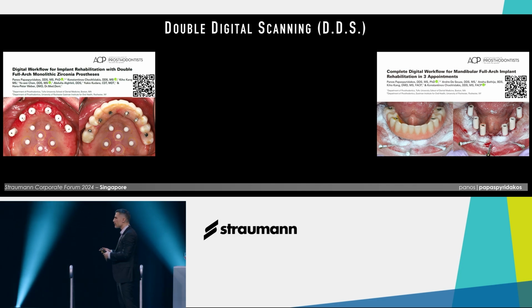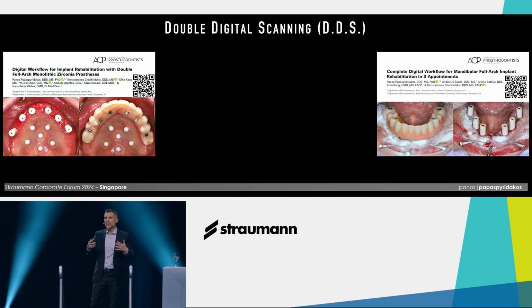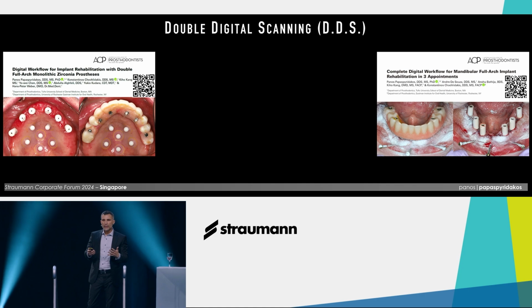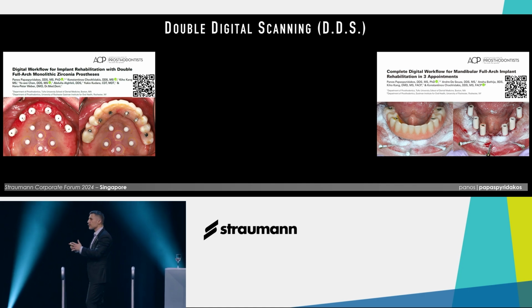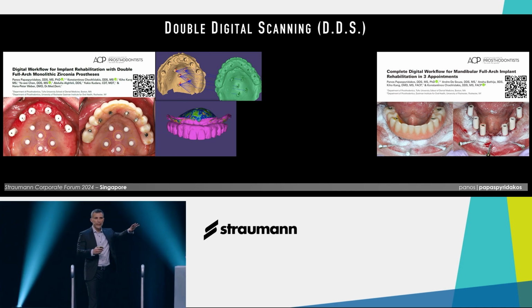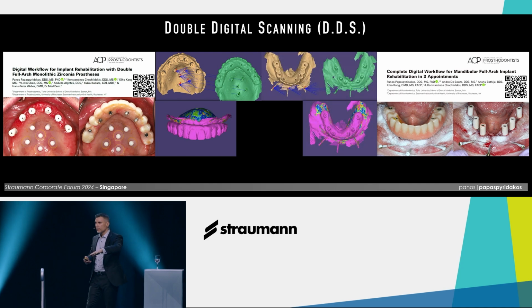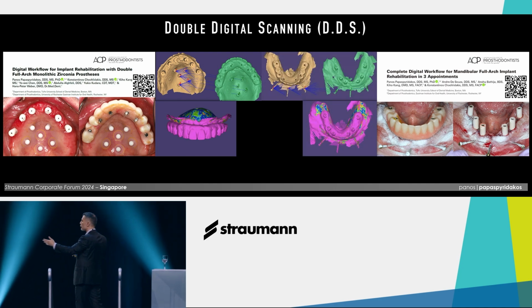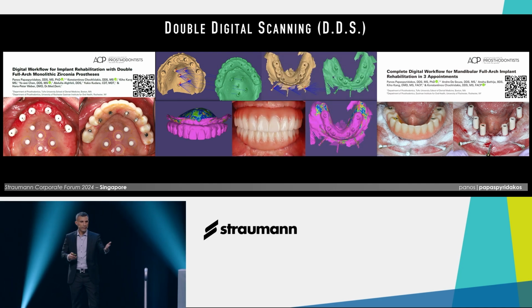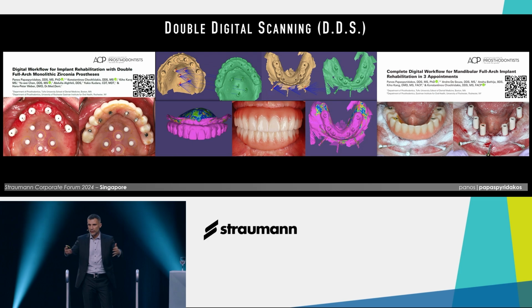Experimentally, in 2018, we published the first paper, and we did a series of publications using fiducial markers to aid the data acquisition with the intraoral scanner and also merge the STL data. So fiducial markers in the maxilla, anchor pins in the mandible, leading to the fabrication of a prototype. Single visit. Life-changing for us and also the patient, shortening the visits.